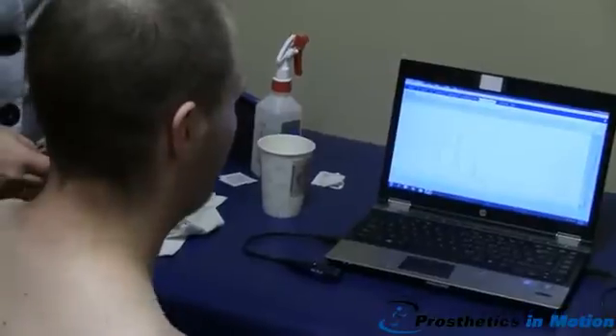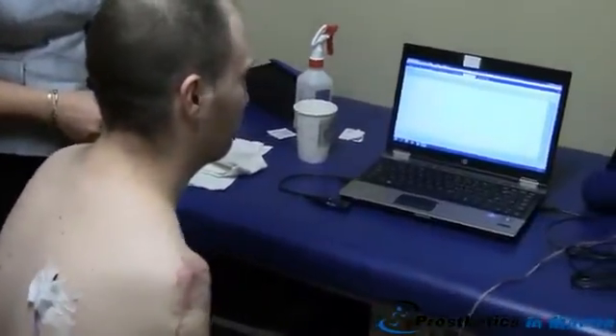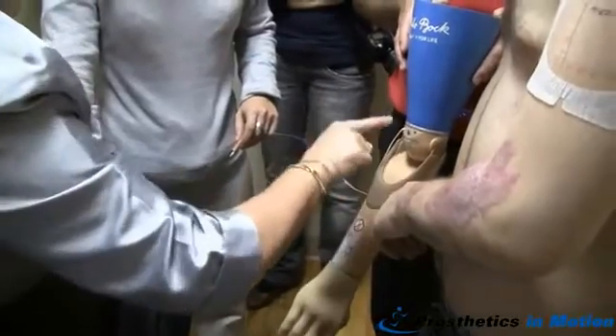Now go forward. Now push it in and let go. Can you hear that? Did you hear those beeps? Yeah — so that's on, off.